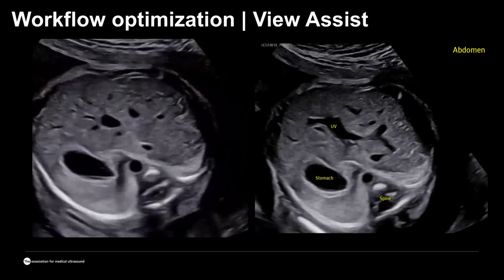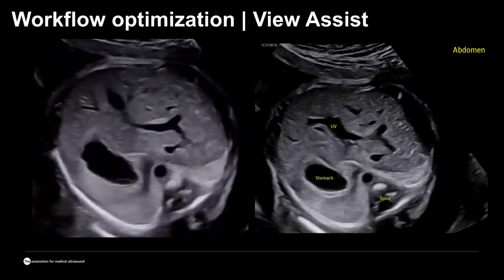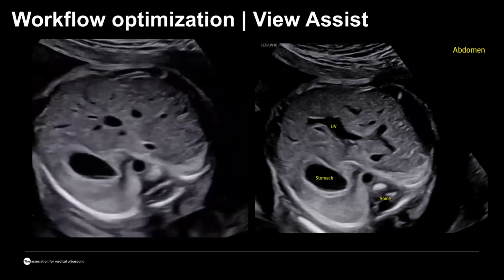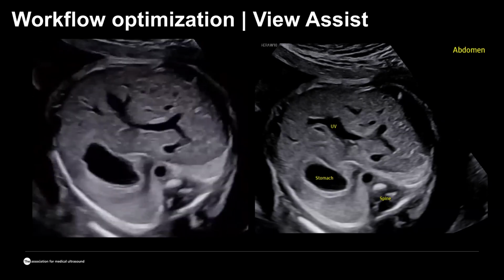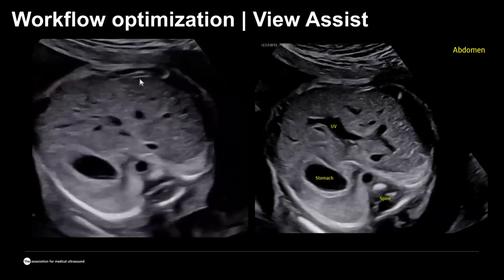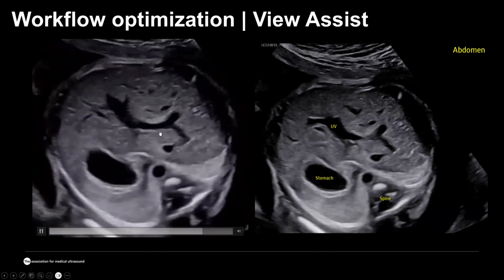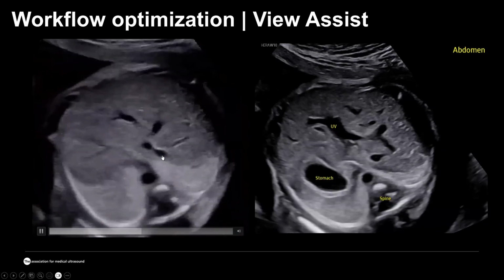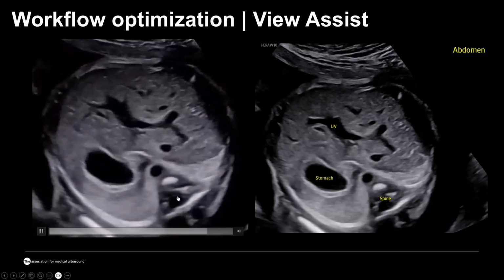This is where all our fetal imaging of the heart is supposed to begin. This is the upper abdominal level where we look at the situs and at the distribution of the different structures that help us identify the situs. And you can clearly see the portal sinus here, the inferior vena cava, the aorta, the spine.